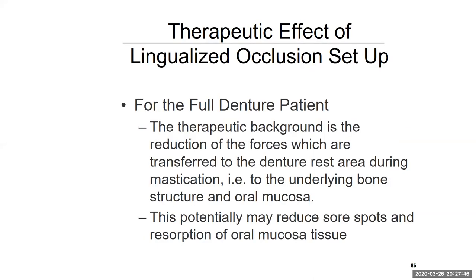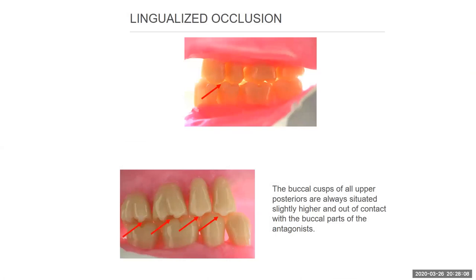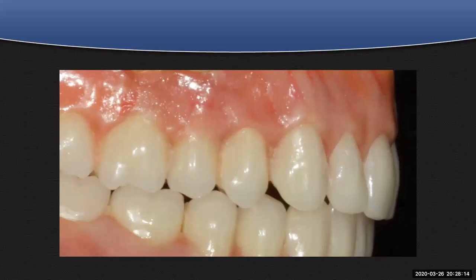For the full denture patient, it's the reduction of the forces which are transferred to the denture rest area during mastication, and to the underlying bone structure and the oral mucosa. This will reduce sore spots and the resorption of tissue. On implant-supported overdentures, it's a reduction of the lateral side-to-side forces on the implant, because lateral forces could cause the implant to fail. And the buccal cusps are pushed out towards the cheek so that you can avoid cheek biting. And there's the final setup with the characterized wax-up.